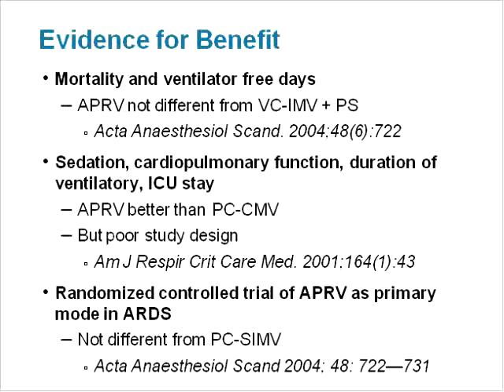Based on our theoretical discussion of the differences between unassisted breathing and full ventilatory support in terms of ventilation perfusion ratios, we might expect that the use of pressure support during APRV could be detrimental. If nothing else, it would potentially prolong the duration of ventilation, as it would complicate the process of deciding which variables to adjust and when for weaning.